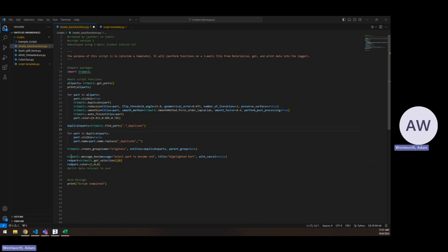Okay. After that, we're putting a prompt or a pop-up that says select part to become red. The user can select a part, which will highlight it blue and put a little bounding box around the part so we can see that. After they click OK from that pop-up, it will grab that selection. And we put this little index value of 0 on it because for some reason it will return a list of parts. Even if there's one object, it will basically have a list of one. And if you're trying to color an object, you can't do that for a list without a loop. You have to do it on a single part at a time. So this essentially makes it a single part and not a list. And then we color that object red, which is just 1, 0, 0.